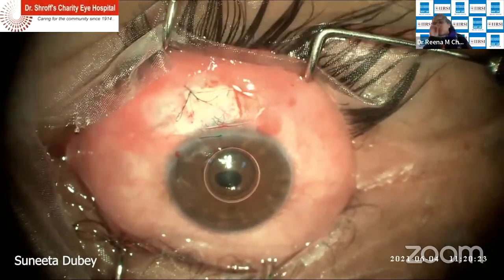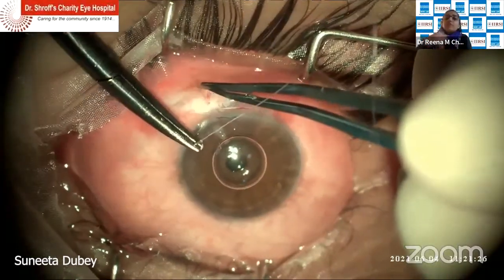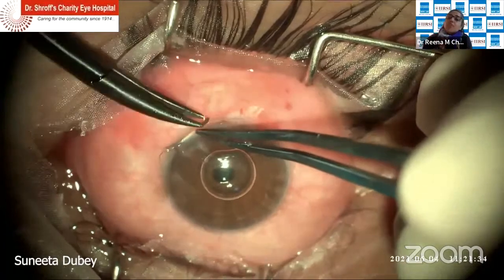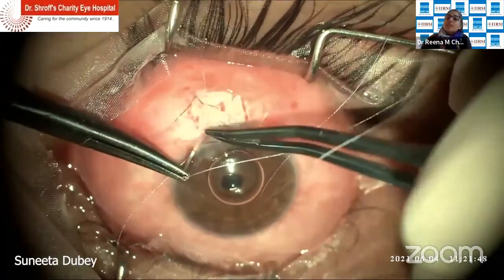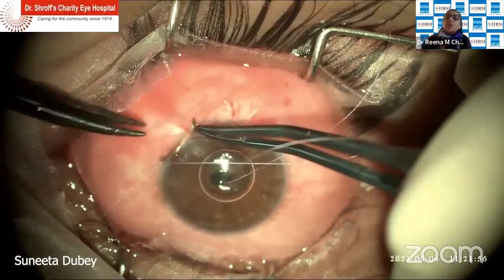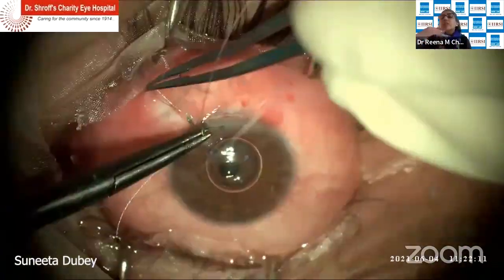It's very important that you don't want an absolutely dry wound. After you've put the sutures, you want to put a little bit of saline from the side port and see how much filtration there is. Use a dry Weck-Cel sponge to assess that. You want just an ooze. You don't want an absolutely watertight wound and you don't want a leaky wound. So what I like is to see an ooze.